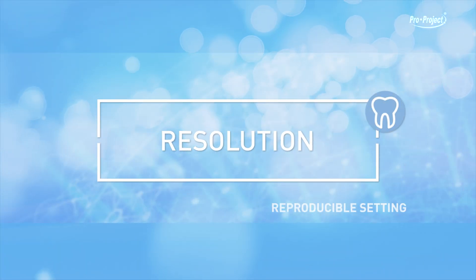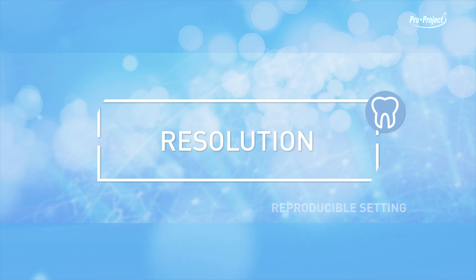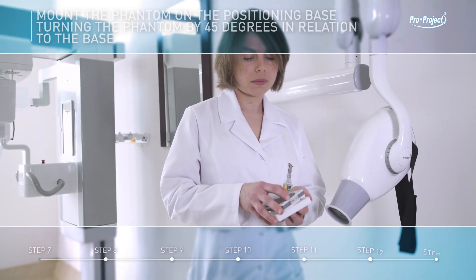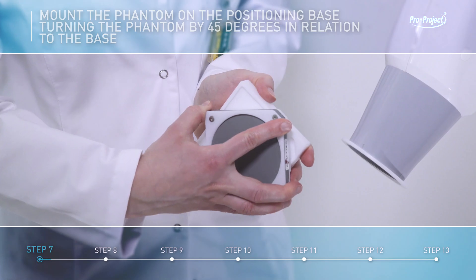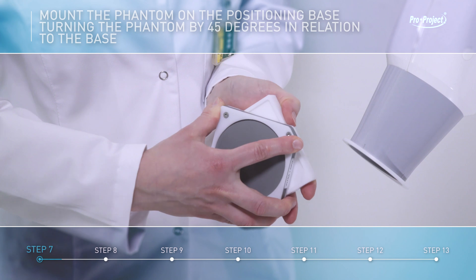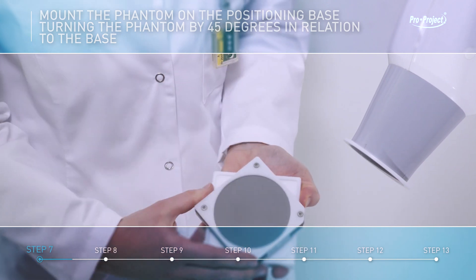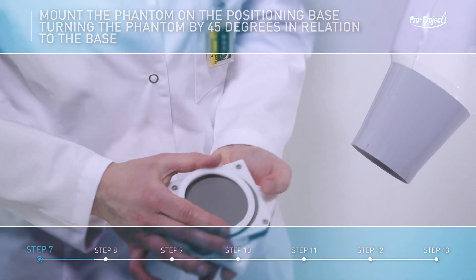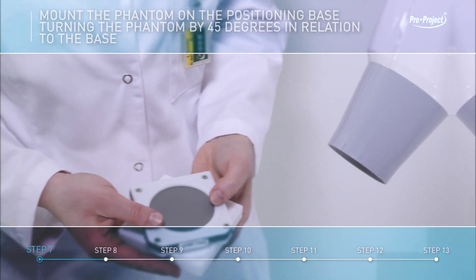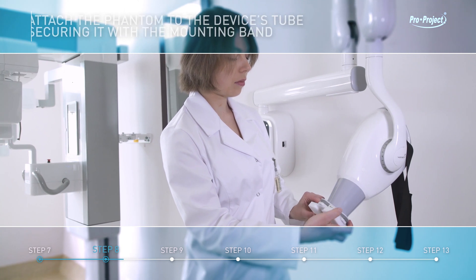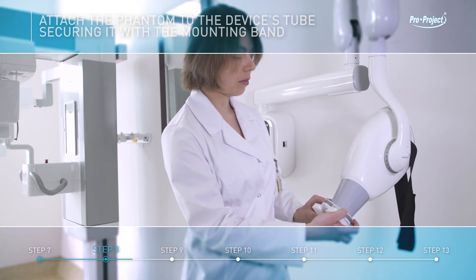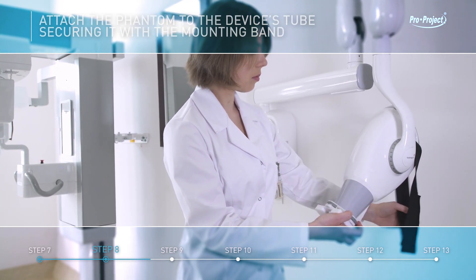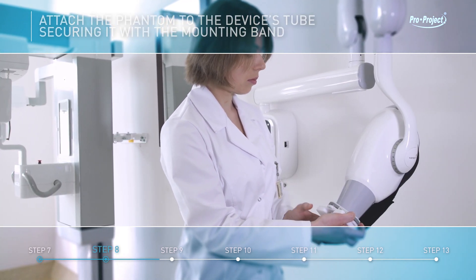Reproducible setting. Mount the phantom on the positioning base, turning the phantom by 45 degrees in relation to the base. Attach the phantom to the device's tube, securing it with the mounting band.